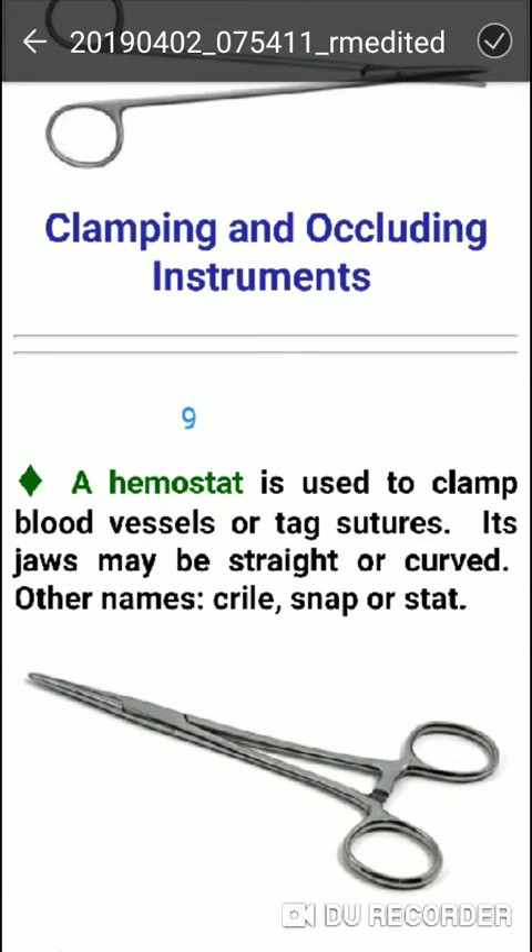First is the Mosquito hemostat. It is used to clamp blood vessels or pass sutures. Its jaw may be straight or curved.